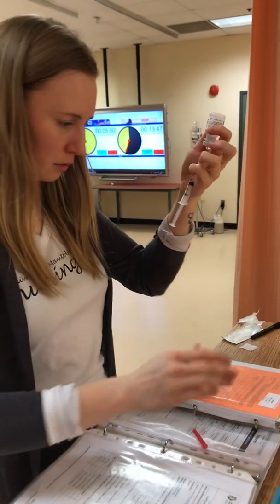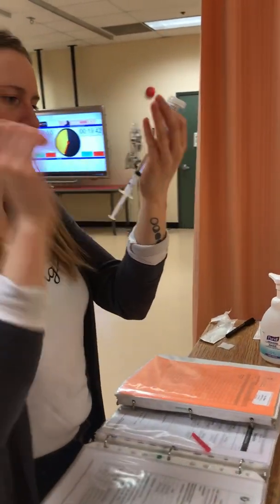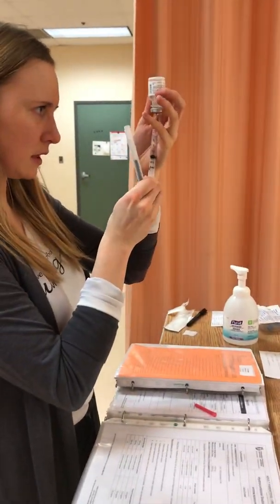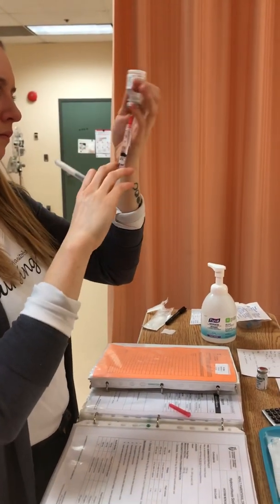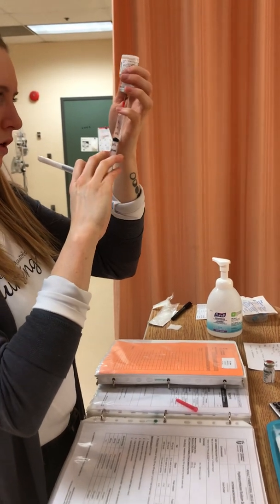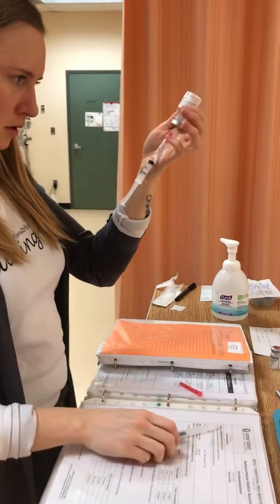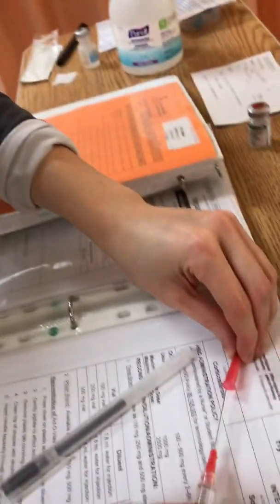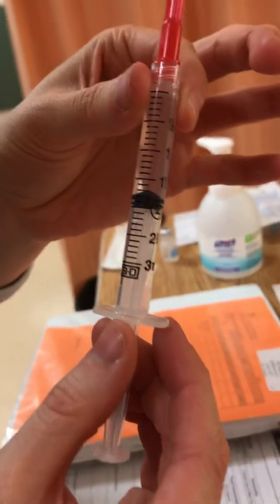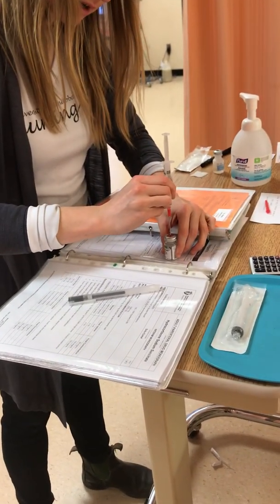Pull it down a little bit more. Pushing it up. Okay, I've got 1.8 of sterile water, which I will be injecting and reconstituting into my hydrocortisone.